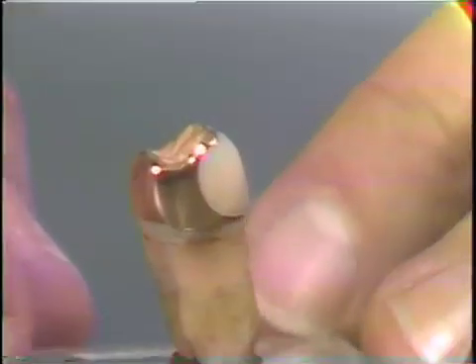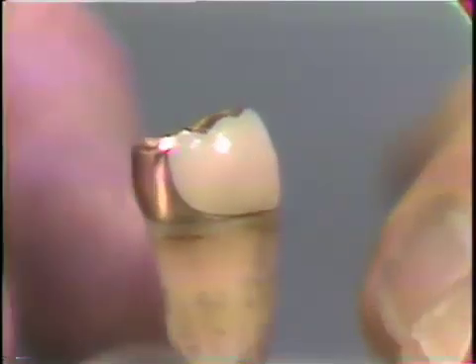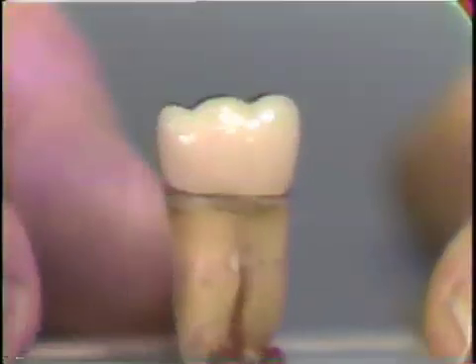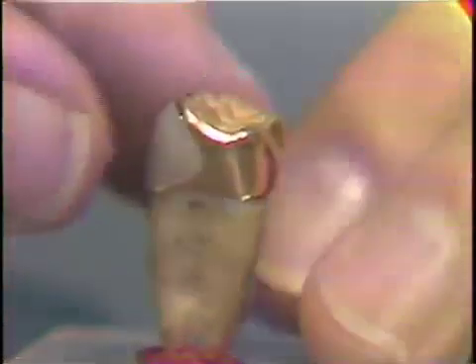The amalgam core crown can be restored with a complete crown of any type, either a veneer crown as is seen here, or an all-gold cast crown, or any other type of crown which is desired. The amalgam core crown, then: amalgam pin retained on a vital tooth.